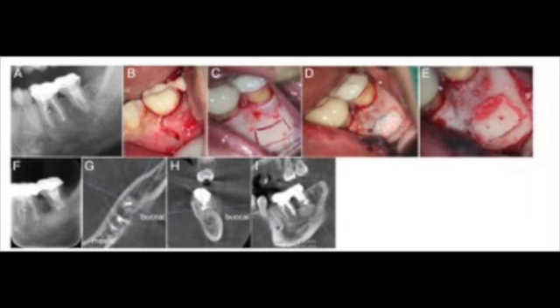Nine cases out of 10 were diagnosed as previously root canal treated with symptomatic apical periodontitis, while one patient had a diagnosis of a combined perio-endo lesion. In their procedure, they mentioned administering a full thickness flap with one vertical release, and they made their bony lid of approximately 5 by 13 mm by making 2 parallel vertical and 2 parallel horizontal grooves on the plate using an ultrasonic osteotome with piezoelectric saw.